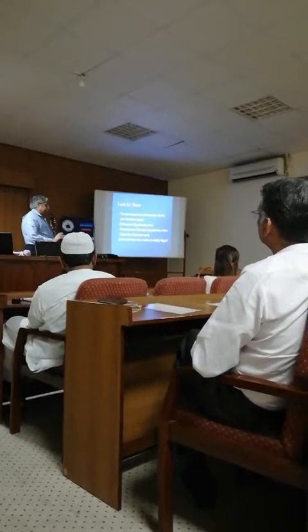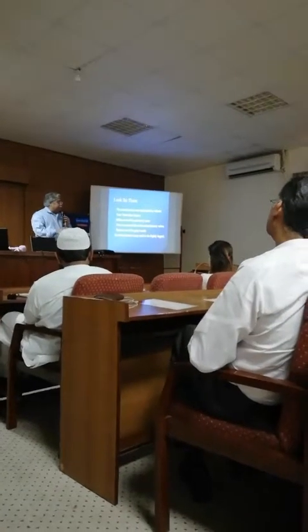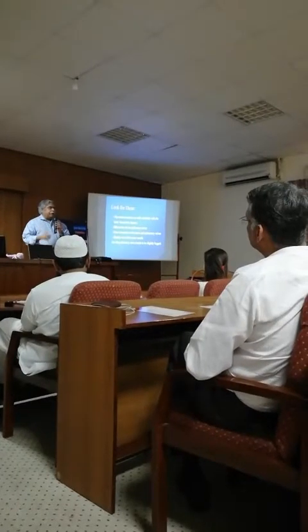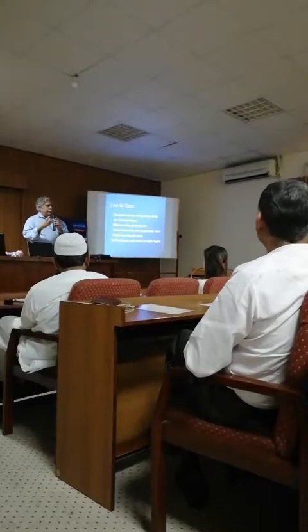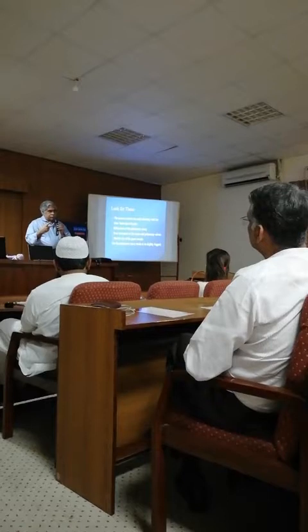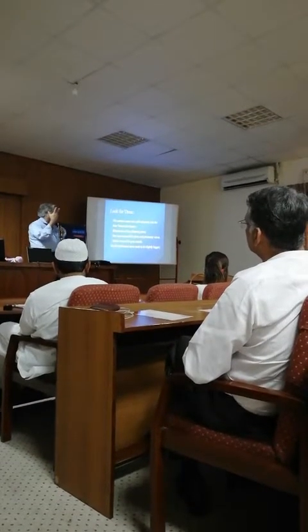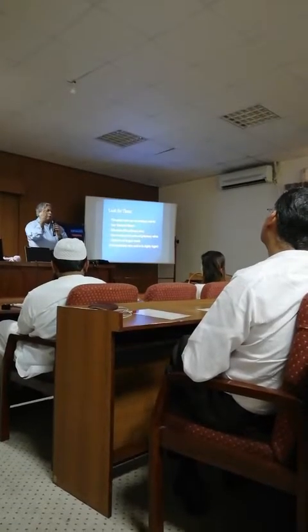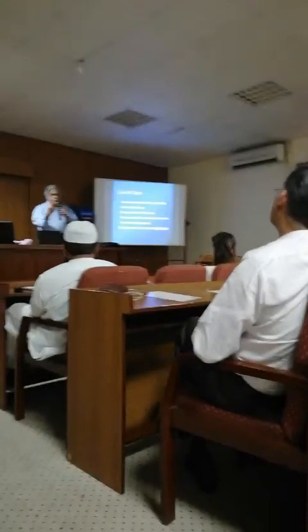Look at the bifurcation of the pulmonary artery. If you're not sure about whether you're looking at the pulmonary artery or the aortic root, it happens very often. Remember that the pulmonary artery trifurcates, and you see two of those. It bifurcates. Usually, you see the right pulmonary artery and the ductus arteriosus. The left pulmonary artery is usually seen less. So if you see a bifurcating great vessel, then you are looking at the pulmonary trunk.